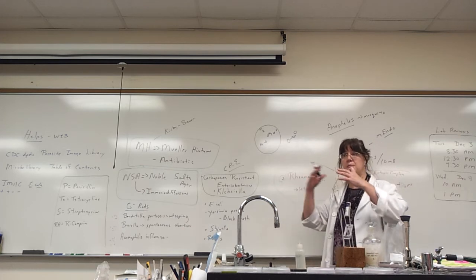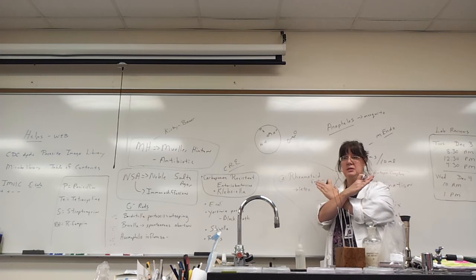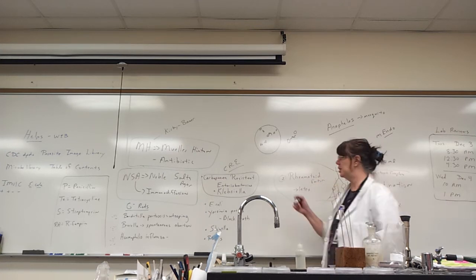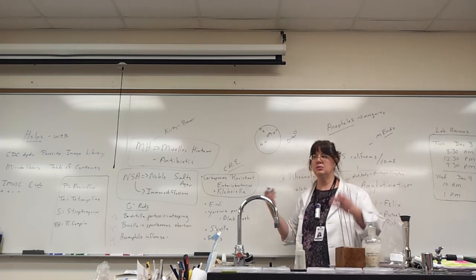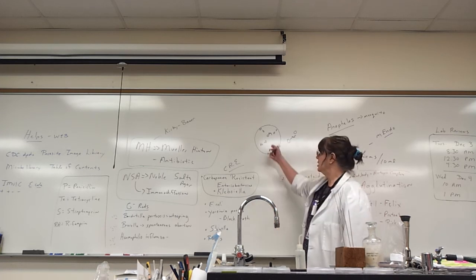If the antibody and antigen don't match, what do they do? They go right past each other. If they match on a plate, it's considered solid, like someone saying the precipitation tonight is going to be snow or ice. It's called precipitation.